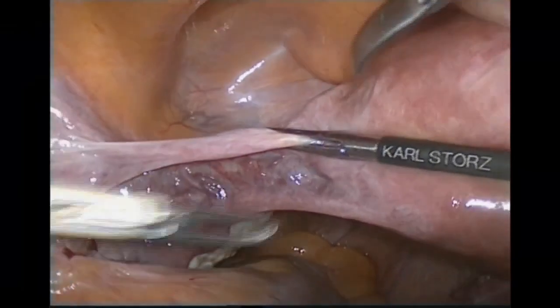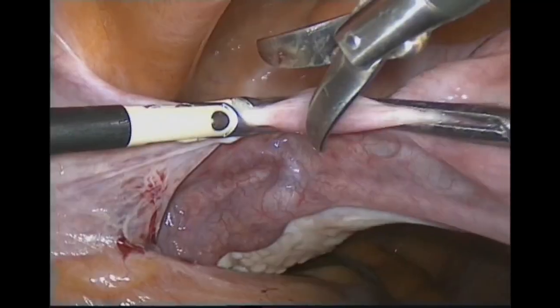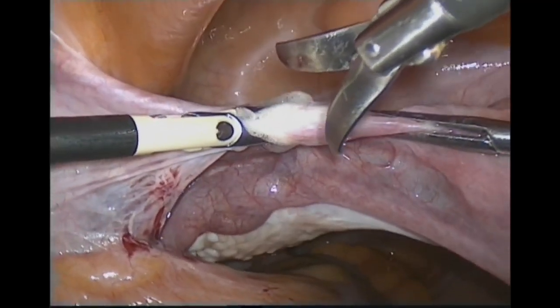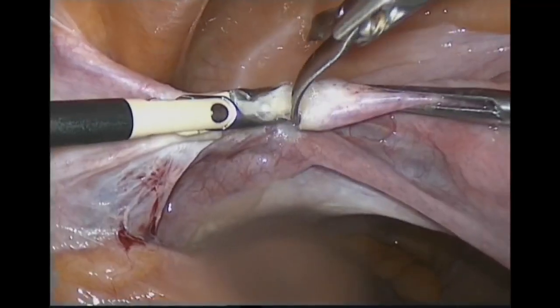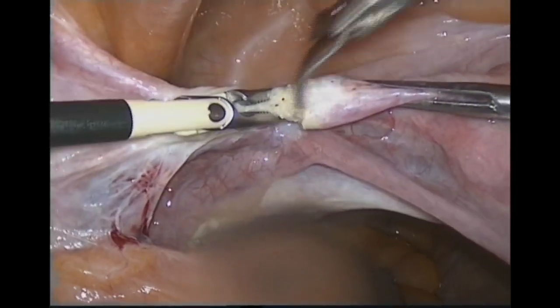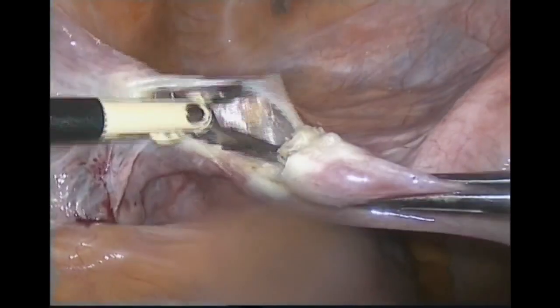In the name of Allah, systematic TLH: medial to lateral, top down. Round ligament, then fold, then bladder, then pedicles, then arteries, then cut, and then lastly close. We will start with the round ligament.